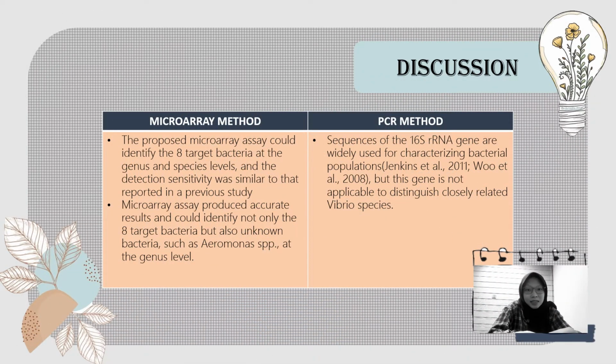Okay, for the discussion, the disease management and evaluation of cultured aquatic animals are major concerns in commercial aquaculture. Rapid identification of pathogens in aquatic animals is important not only to avoid economic losses but also to enable animal health management. Based on the results obtained using 2 different methods, the microarray test has produced accurate results and can identify not only target bacteria but also unknown bacteria such as Aeromonas species at genus level.